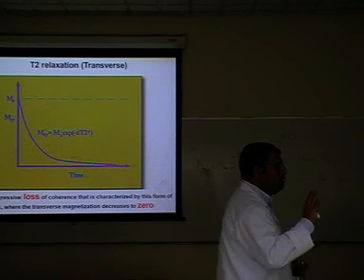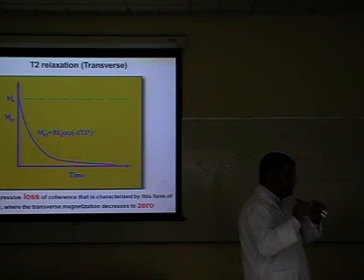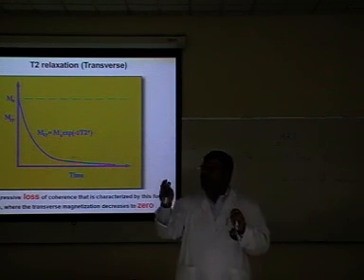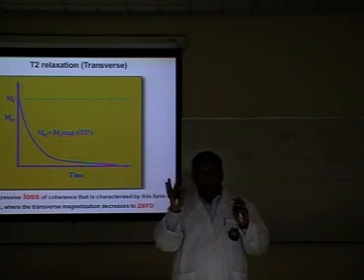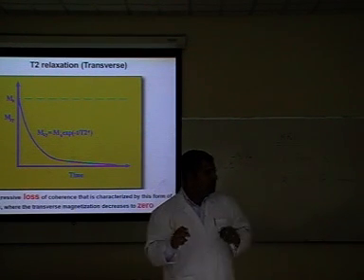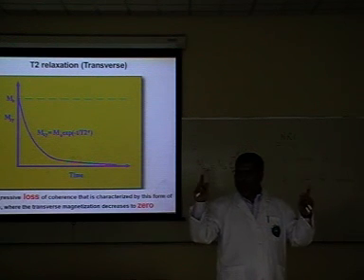Now, one thing that you missed, which I started the class with, is resonance. What's the significance of the resonance frequency? Remember, MRI is magnetic resonance, and there is a big part of magnetic. Resonance occurs at the same frequency as the precession frequency.